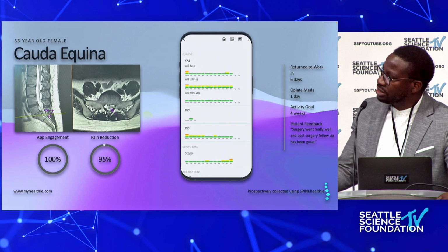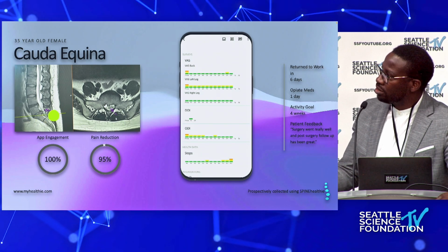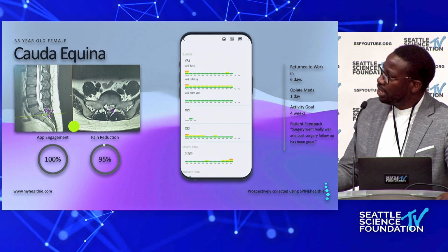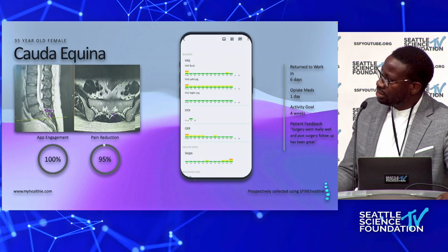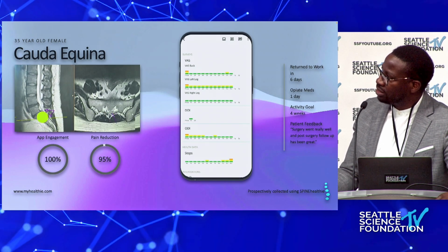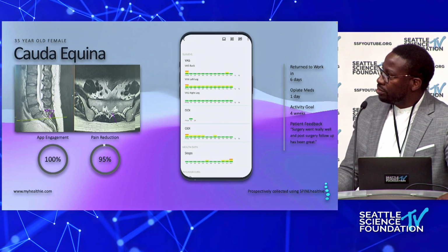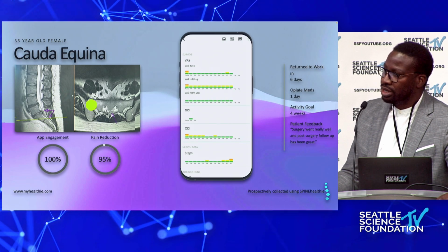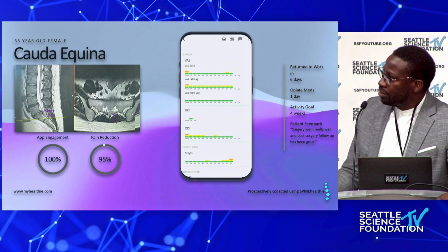His biggest concern was, you can see that there's some caudal migration behind the sacrum, the dorsal ala or lamina of the sacrum, and it's gone down and is now entangled in the nerve roots. And you can see this is another image further down in the sacrum, almost at the level of S2. So for a person doing this case tubular, that's a pretty long reach for a tubular approach and a microscope. So we did this case endoscopically, interlaminar.